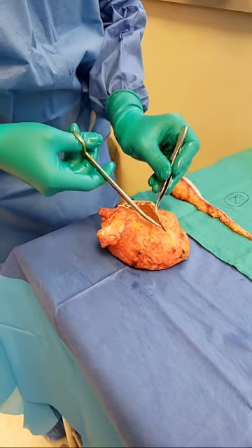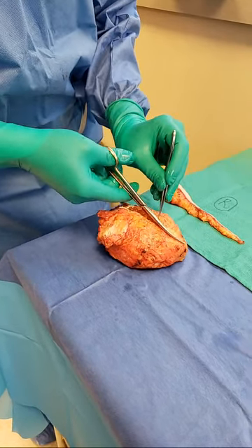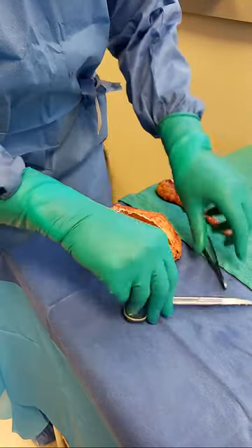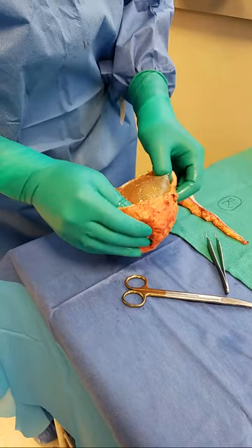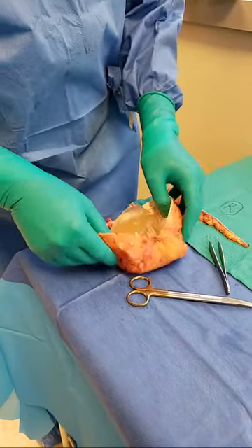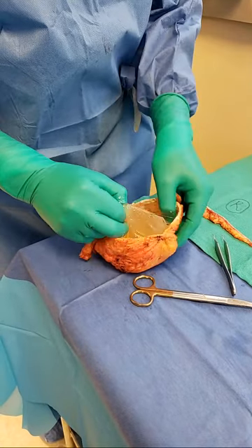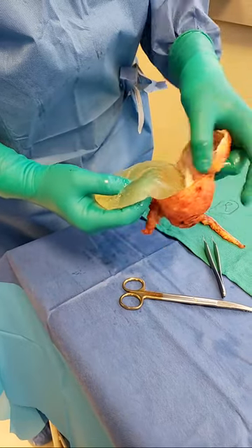There are a lot of surgeons who will say, so what if the silicone spills into the chest? That is a big no-no. It is a catastrophe if the silicone spills into the chest. The whole goal is to do it in a very safe, controlled way. I'm going to go ahead and pull out this ruptured implant — all contained, en bloc. You can see how it was folded up on itself.